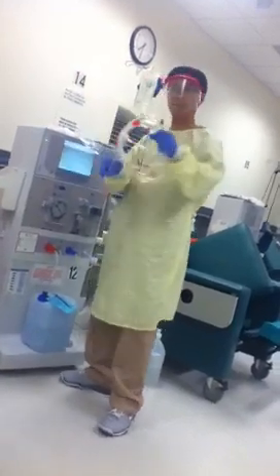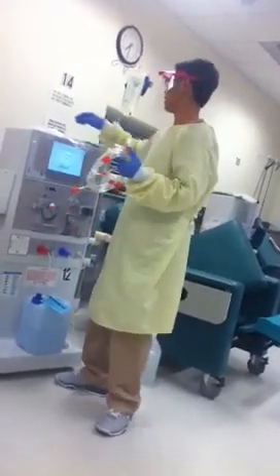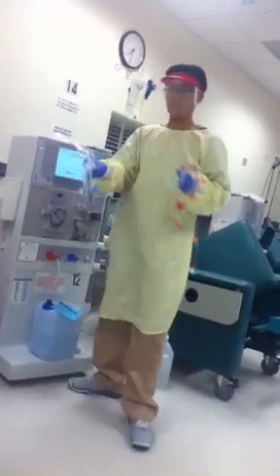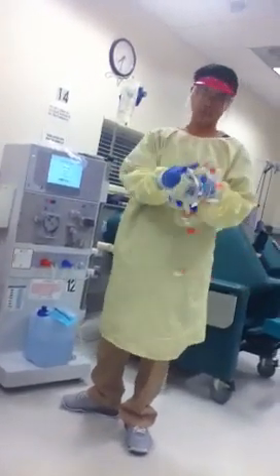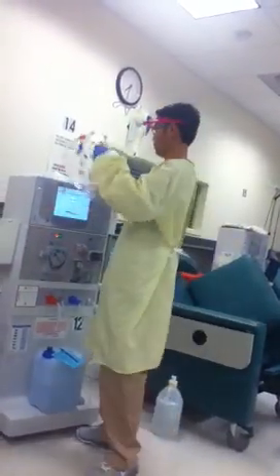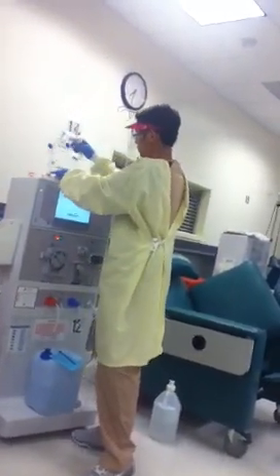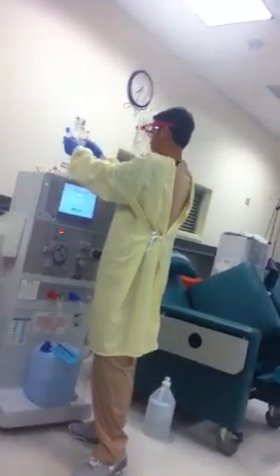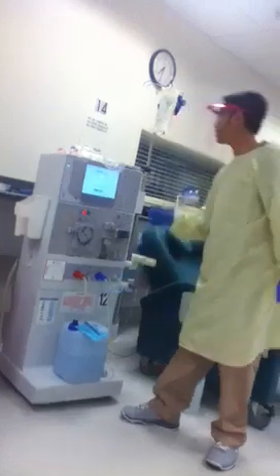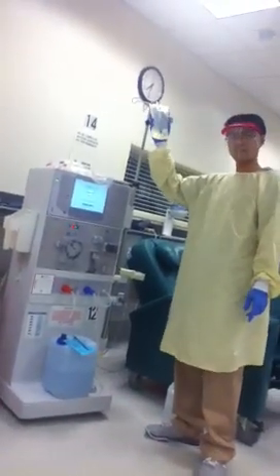So we have the arterial line. The venous line, color blue, and the IV line. And we also need the bicarb, and of course the saline solution.